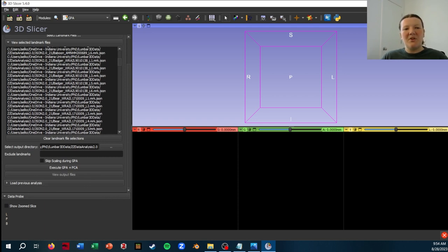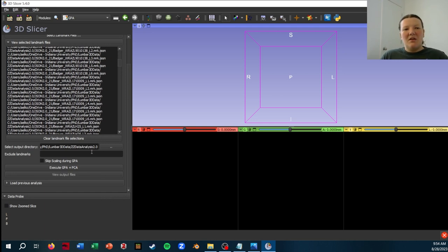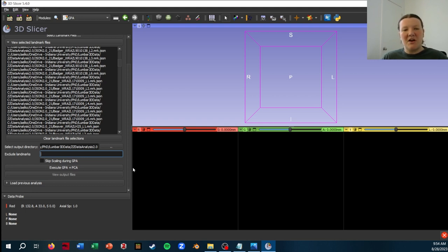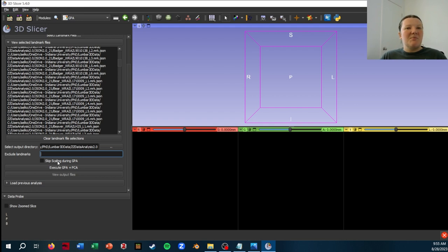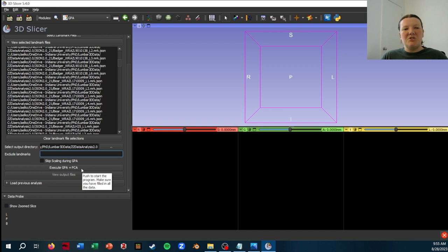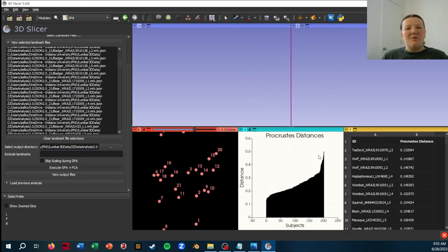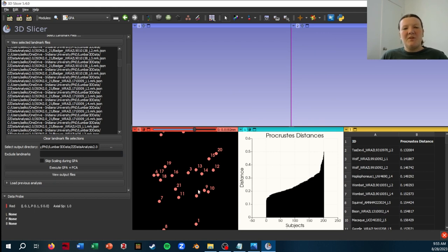So now I have the option to exclude landmarks if I want. This is where knowing what landmarks and what order is useful. I'm not going to do that. I want all the landmarks in this analysis. You also have the option to skip scaling during the GPA, but I'm not going to do that. So I'll click Execute GPA plus PCA. Sometimes it doesn't look like it's doing something for a while, but it worked pretty quickly here. And now we'll already start to see some results.